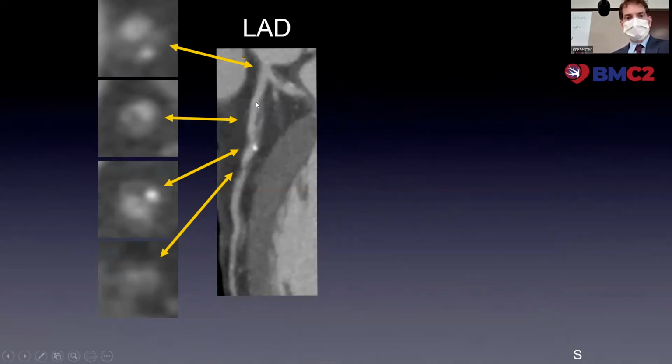If you go down the artery, even down here where the artery doesn't look too bad, there's certainly plenty of lumen here. You see all this stuff around it. This is all plaque. This is something called positive remodeling, where the artery stretches outward, kind of dilates, to preserve the lumen but accommodate the plaque that's present. This is considered something that could potentially be higher risk, putting patients at future risk of acute coronary syndrome. But a lot of plaque.